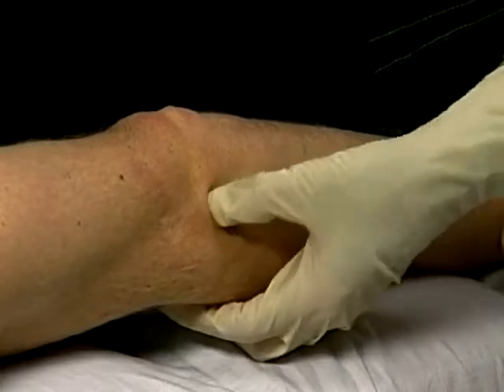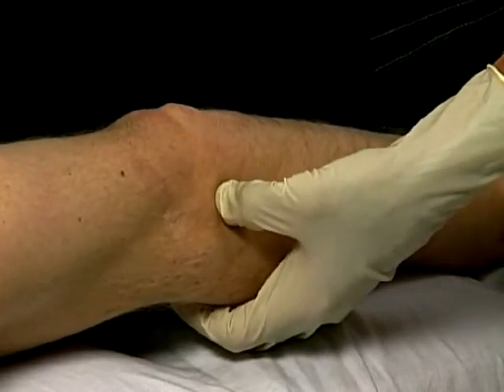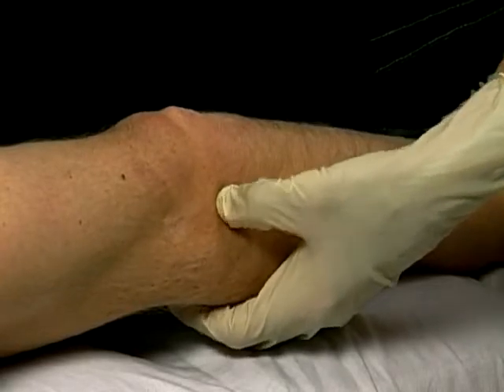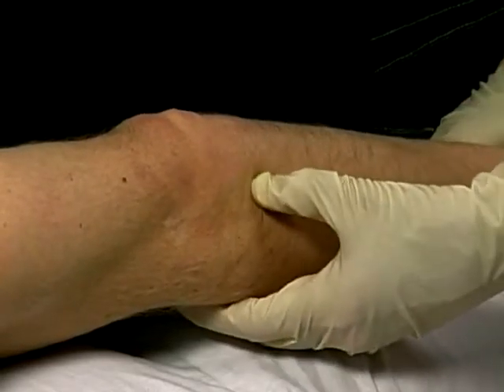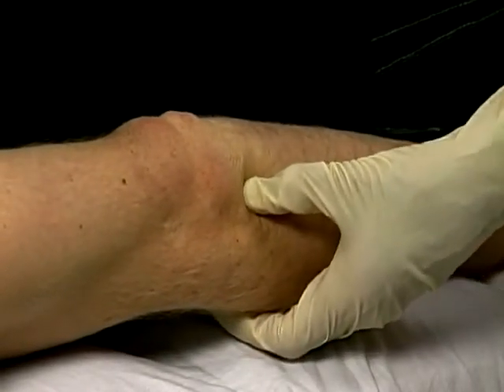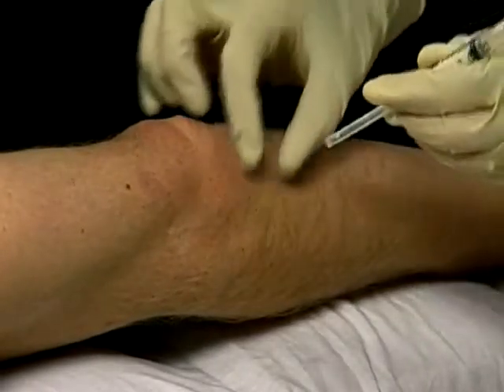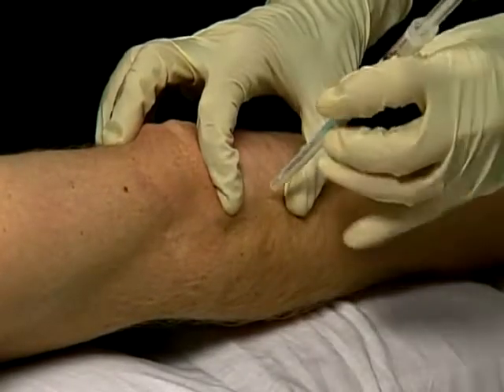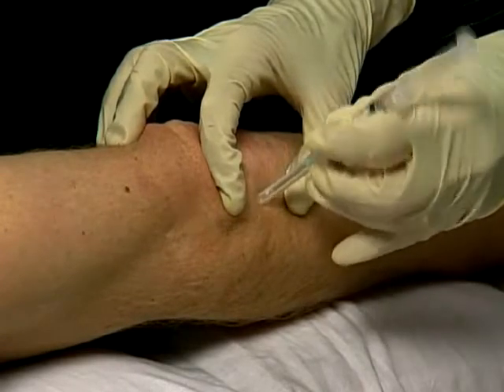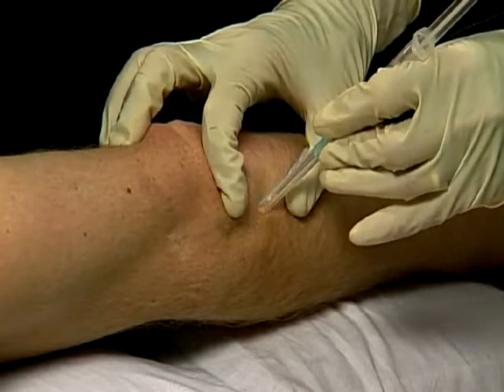Identify the line of the joint between the head of the radius and the humerus. Feel the radial tuberosity 1 thumb width distal. Mark this entry point, clean and firmly stretch the skin, and rapidly insert the needle perpendicularly down to touch bone. Aspirate and inject bursa as a bolus or pepper into tendon insertion.